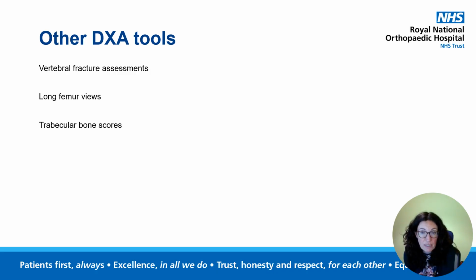These are increasingly helpful if we're possibly monitoring for atypical femoral fractures. And the International Society for Clinical Densitometry has some guidelines over who should have them, depending on how long treatment's been on. And some of you may be using trabecular bone score, TBS, to give an idea of bone quality as part of DXA. So those are other ways that DXAs can help us in our management.